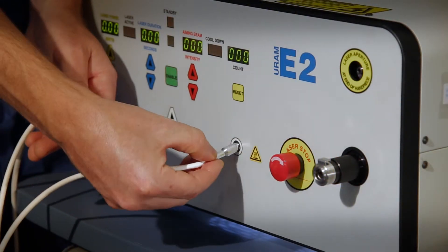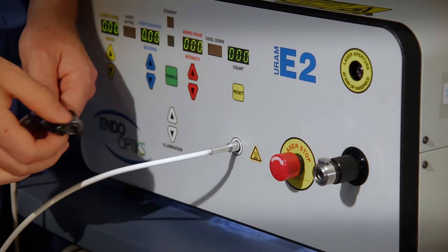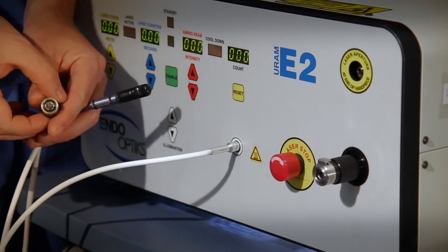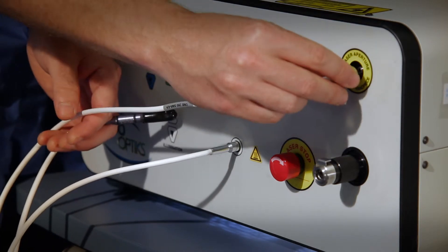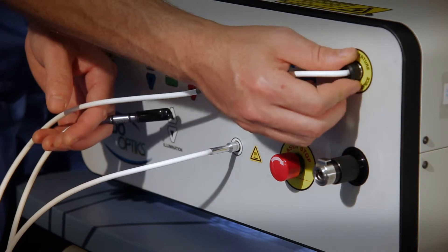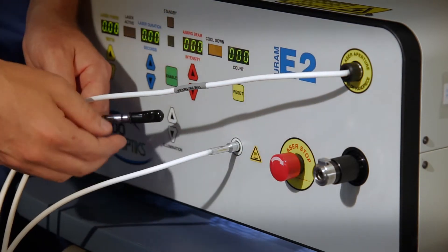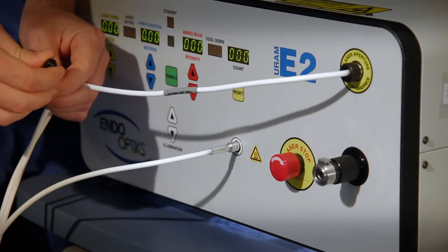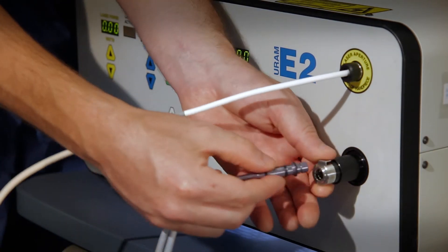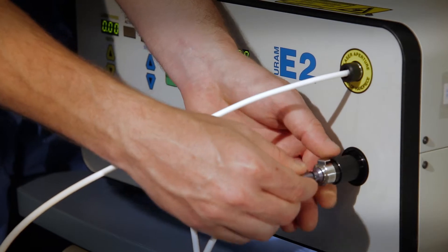There is no set order for connecting the three ends, but the best technique is to insert the light first and then screw the laser connector into its port. Now you can push the lever on the video adapter with one hand while inserting the video connector with the other until it clicks into place.